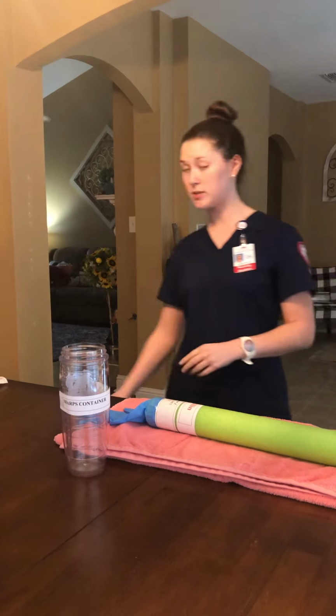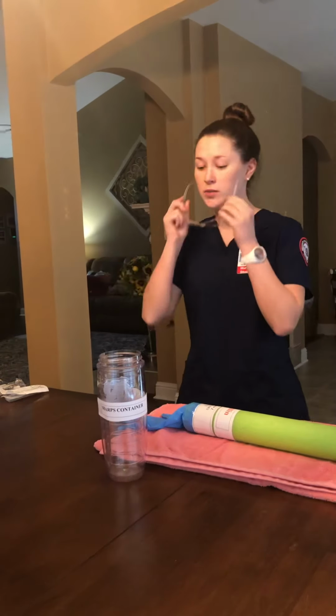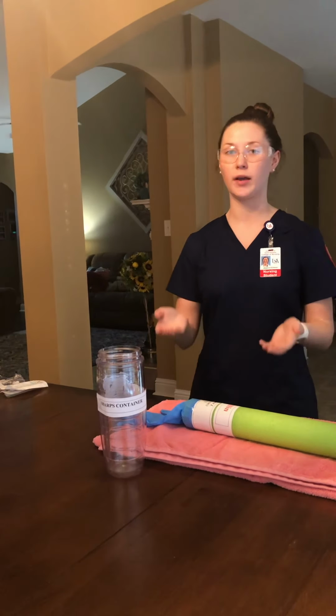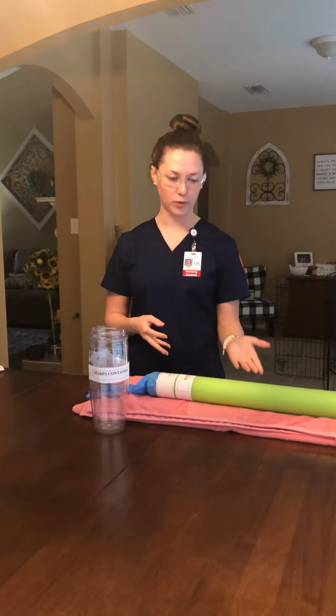So the next thing I would do is position the trash can, perform hand hygiene, and now I want to don my goggles. So now I would want to raise the bed to a working height, lower the side rail, and position my patient comfortably. I would put them either supine or in a sitting position, and I would do this while maintaining privacy.